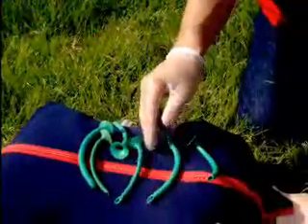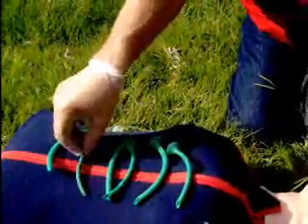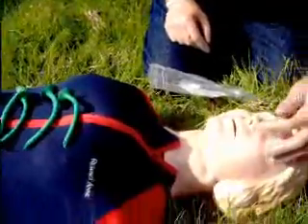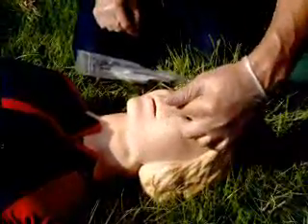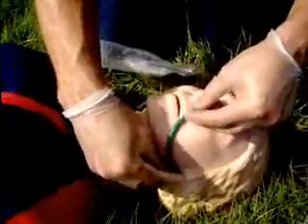Second, the measurement method is from the edge of the nose, where it's going to go in, to the ear. So take one here. You can see here that this one will work. But you also have a secondary factor because they have different diameters, and so you need to match the diameter with what goes in. When you put an airway in, you want it to follow the natural curve of the nasal airway. So it's going to be like this.